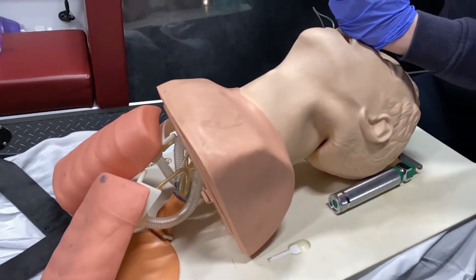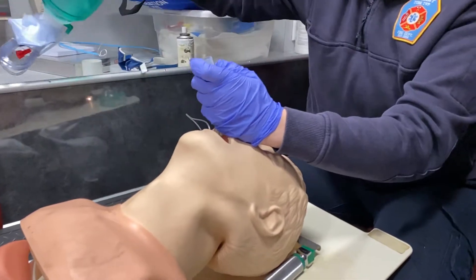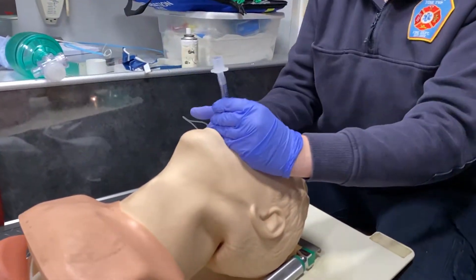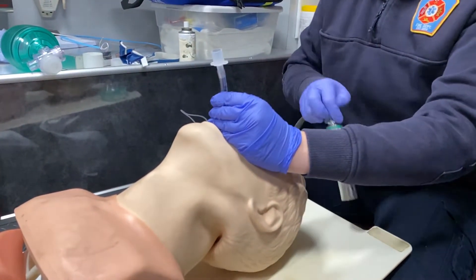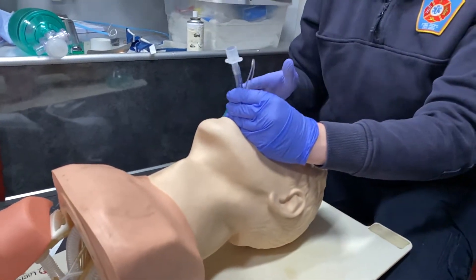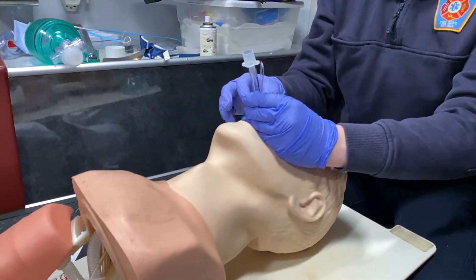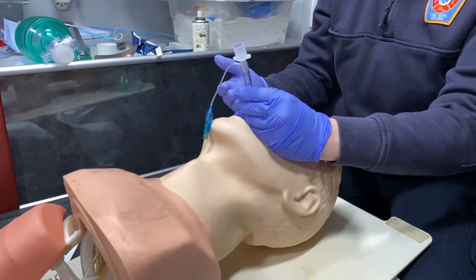I want to secure this tube just like I did my King. So I'm going to pass my bag off to my partner. I'm still holding on to this tube because I don't want to risk it falling out, especially if you're doing CPR on the patient — even the Lucas device can push this tube outward.